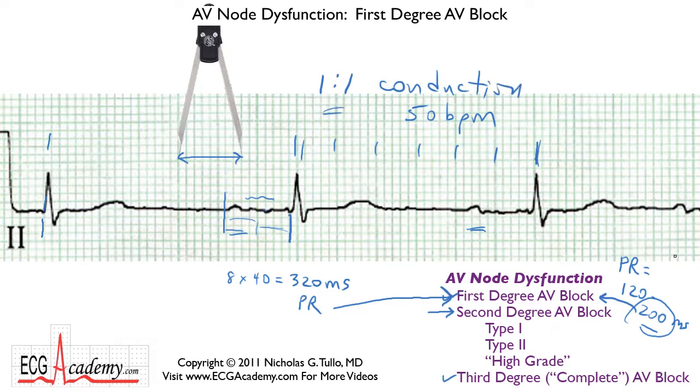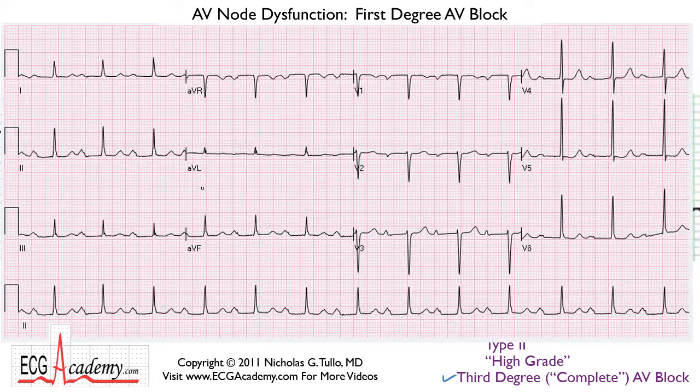Well, let's look at a couple of other examples. Now, here's a 12 lead, but I want you to concentrate on the rhythm strip down here on lead 2. If you kind of scan across, look at the forest first, you can see that the QRS complexes are quite regular, and they're at a rate of, I'd say a little above 75, maybe 76 or 77 beats per minute.